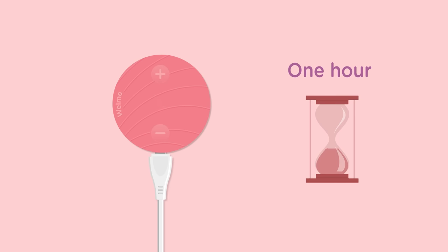After every period cycle, you can charge the device for one hour to prepare for the next usage. Because, why take a chance? Store Wellme in a cool and dry place and that's it.